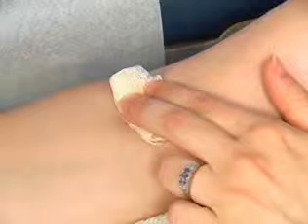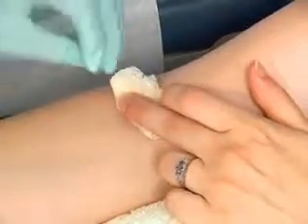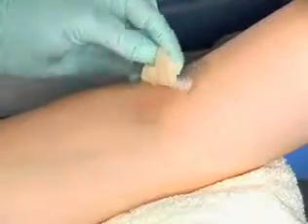You must continue to apply pressure for 1 to 2 minutes with the gauze pad to reduce the leakage of blood from the puncture site externally or internally. The arm can be elevated to facilitate clot formation. Do not allow the patient to bend the arm at the elbow because this increases blood loss from the puncture site. Stay with the patient until the bleeding has stopped.